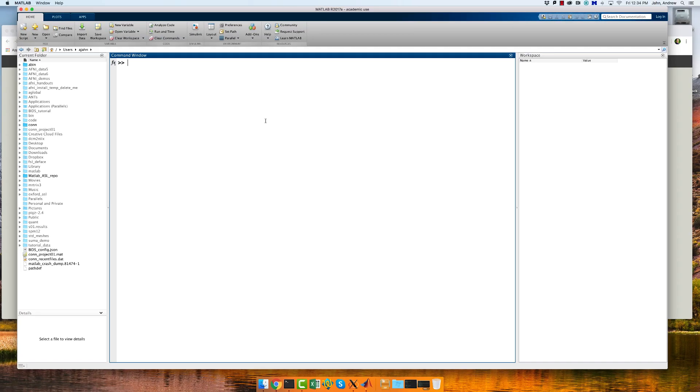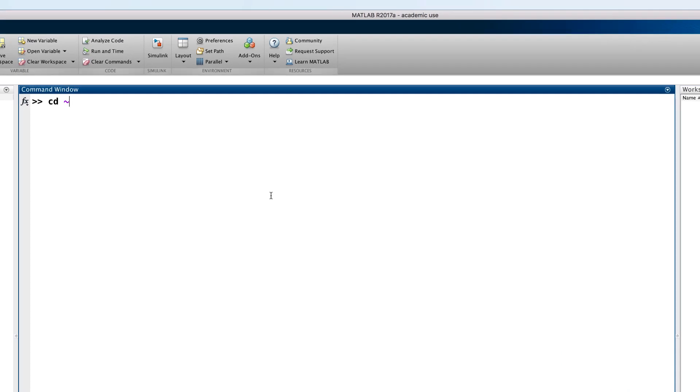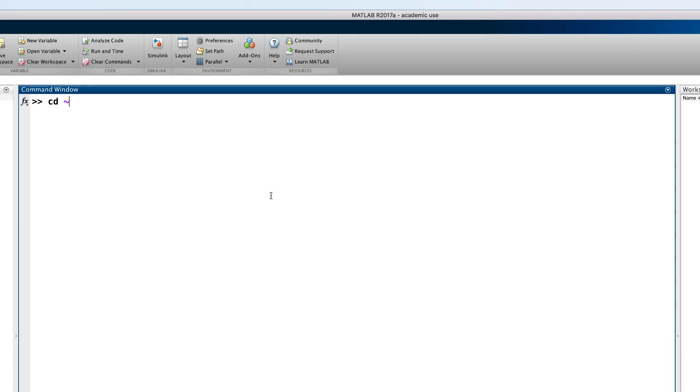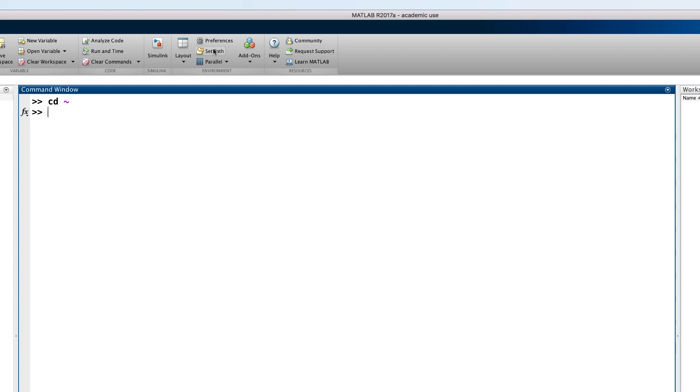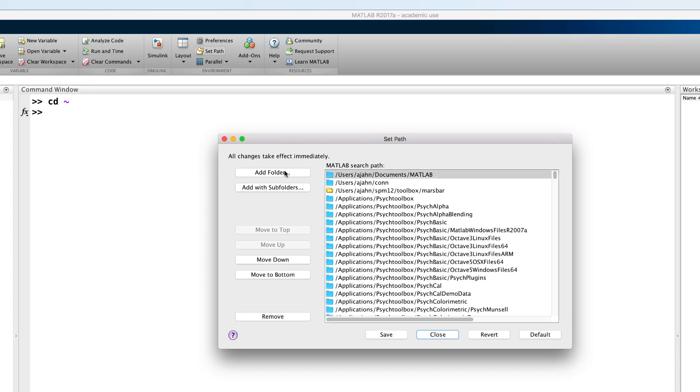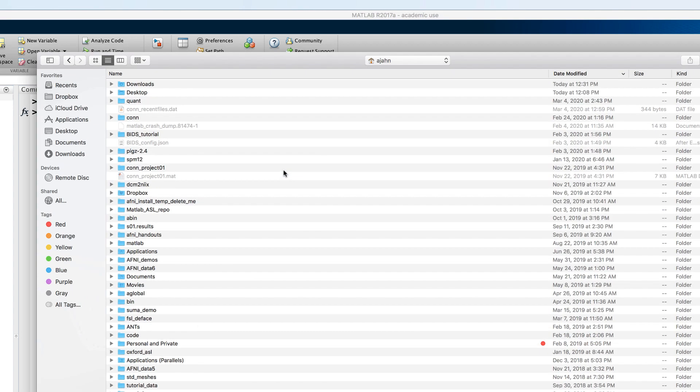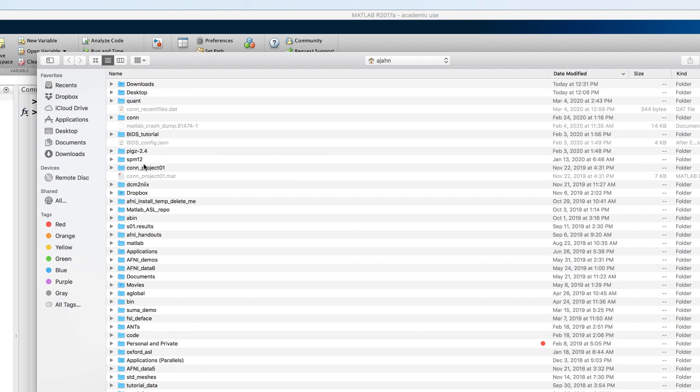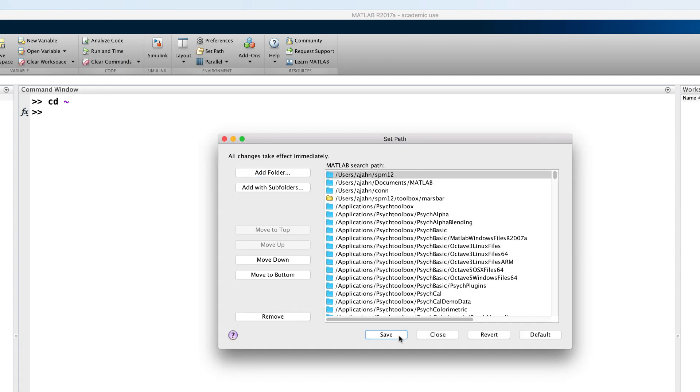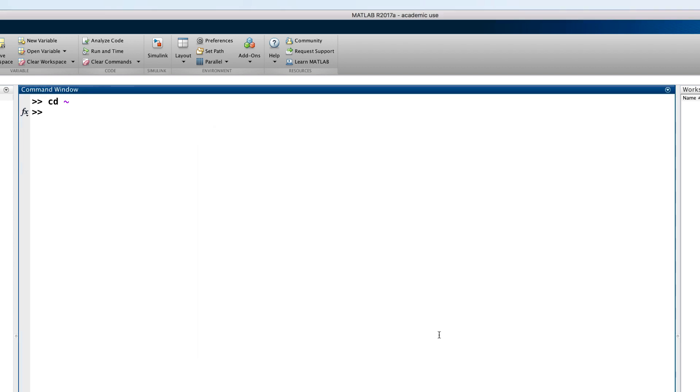Once you have finished moving it to your home directory, open up MATLAB, then click on the Home tab, and then click the Set Path button. From this screen, select the SPM 12 directory in your home folder, and then click Open. And then Save to automatically set the path each time MATLAB is opened. And then close the window.